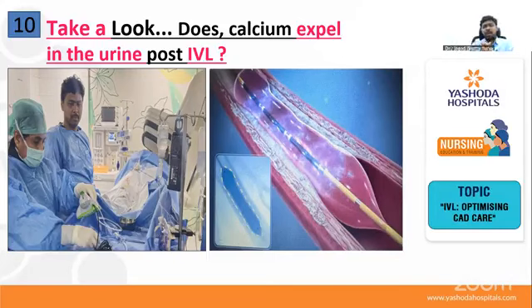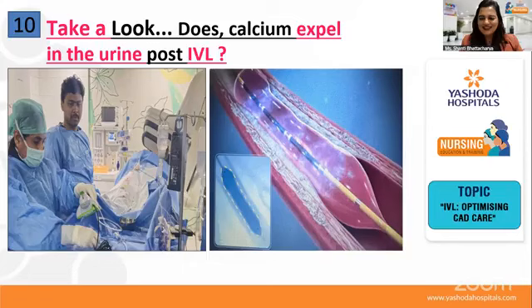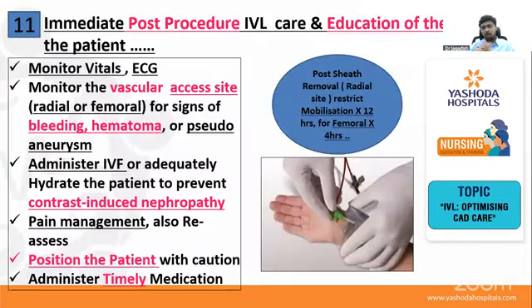You can imagine a stent is like a small spring, and if I am opening a spring in cheese, it slowly opens. But if I'm opening a stent in a hard rock, it doesn't open. So we use the same technique. This is like a carpenter who is trying to drill a hole.